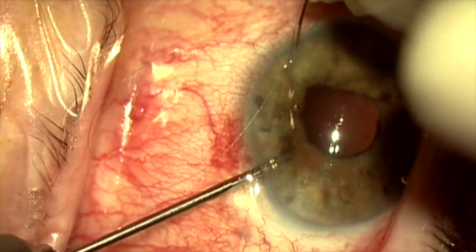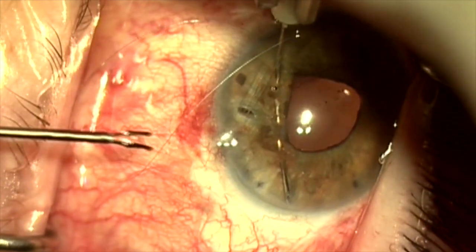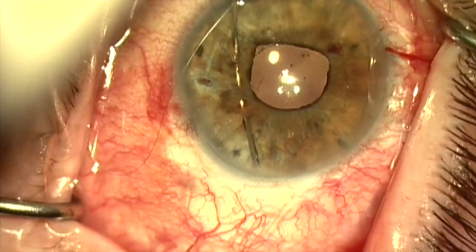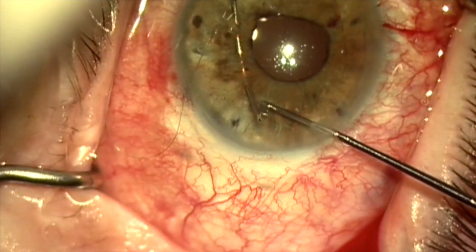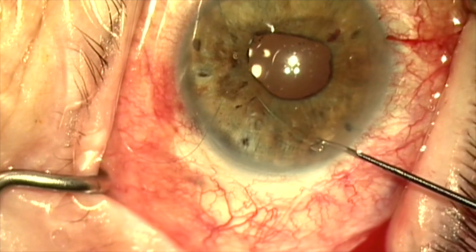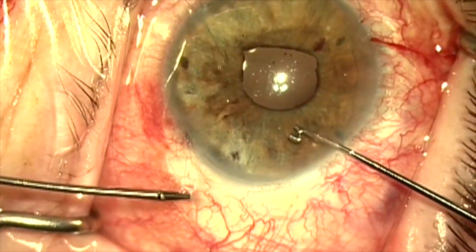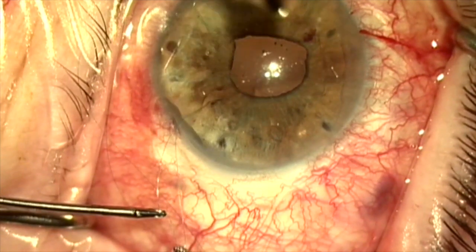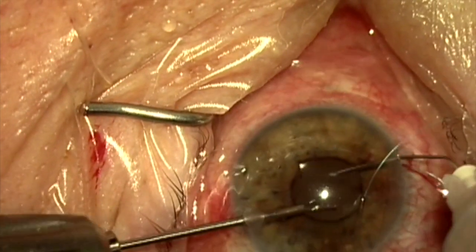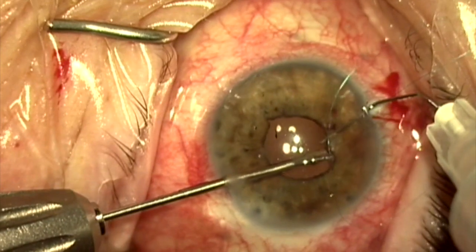The idea is to limit the amount of dilation to the size of my cerclage without distorting the pupil margin, and to allow a little bit of sphincter function to regulate pupil size. Here I'm transferring the needle to my left hand and using a mini Kuglen hook to hold the suture as I back the hypodermic needle out. I'll grab the tip of the suture and pull it out of the paracentesis, then take the other half of the suture loaded in the 33-gauge needle and enter the original paracentesis to go the other 180 degrees.